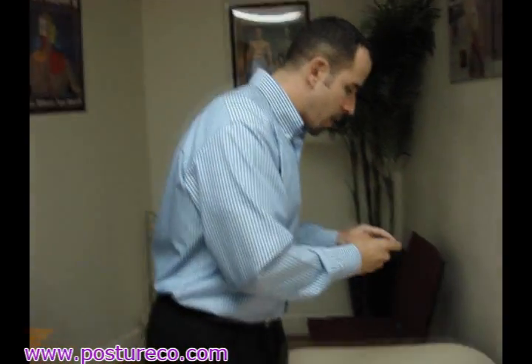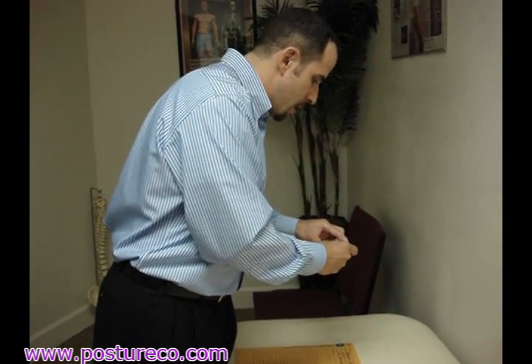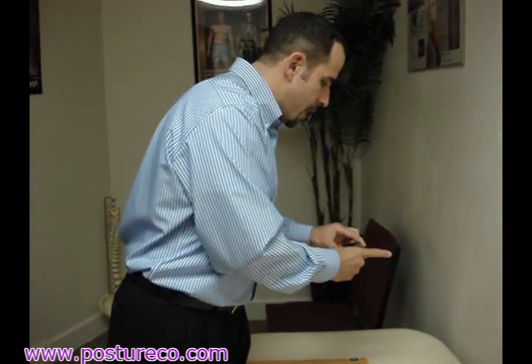So I'm going to go ahead and turn on my camera, and it's laying right here. So I'm going to go ahead and snap a picture of her folder. Okay. And next, now that I've obtained that, I know every subsequent picture after her patient jacket belongs to that patient. So that way, if we store these on our hard drive, we never make a mistake on not knowing what X-ray goes with what patient. You have to do that. If you don't, you're going to get confused.